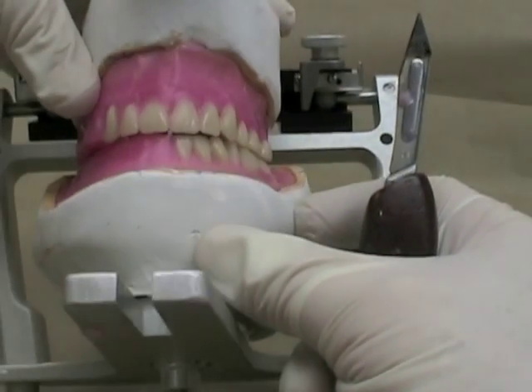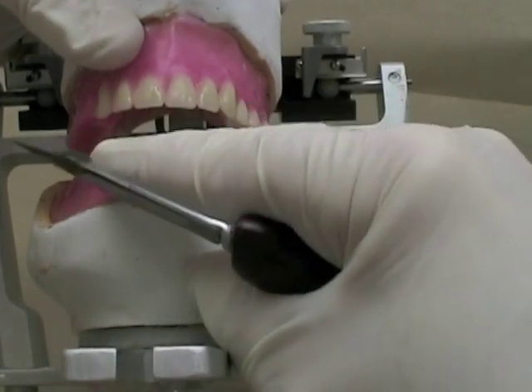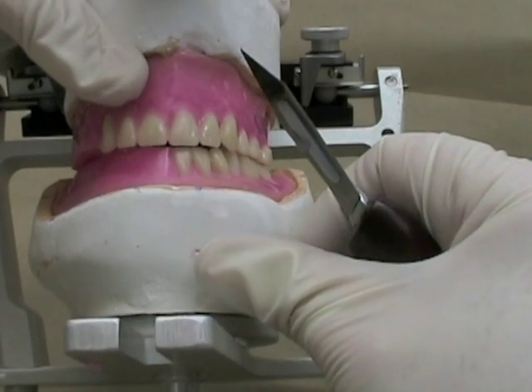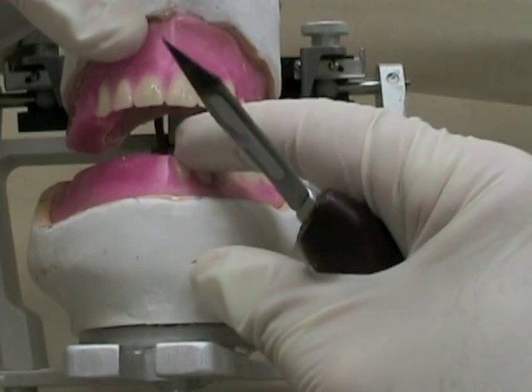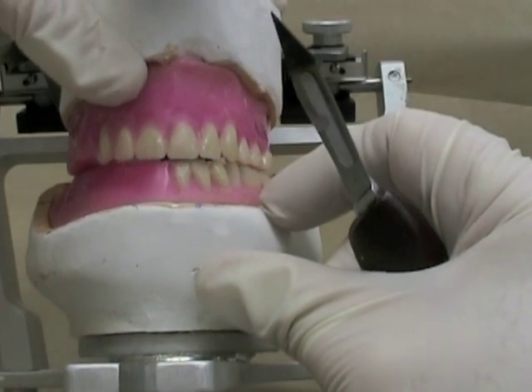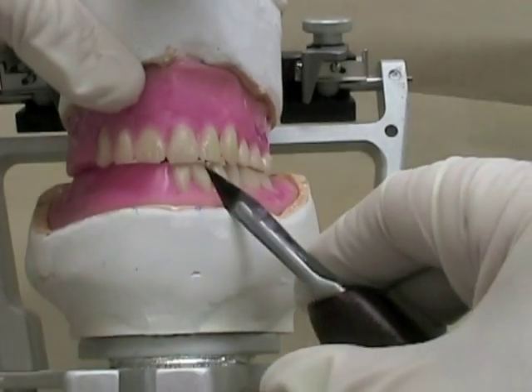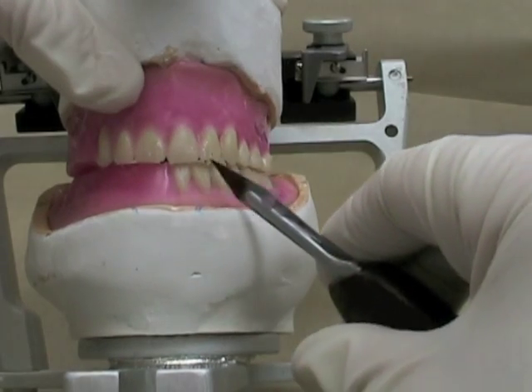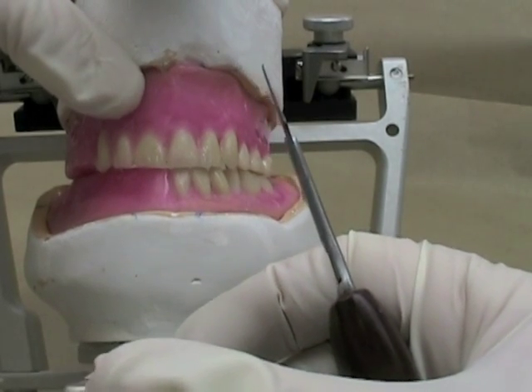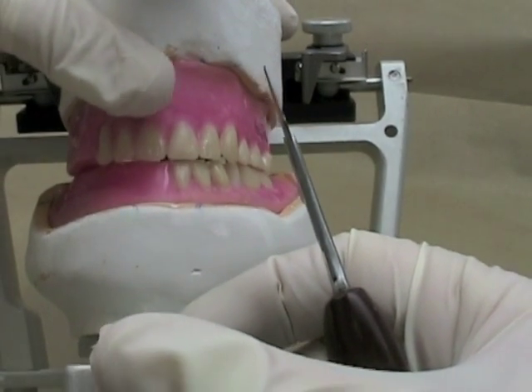The next thing I'm going to do is start to set the mandibular anterior teeth. I'm going to set them roughly approximately at the same level. The lateral incisal edge is not lower than the rest, but as you move toward the posterior toward the canine, the cervical portion starts to angle a little bit towards the most posterior aspect of the denture.